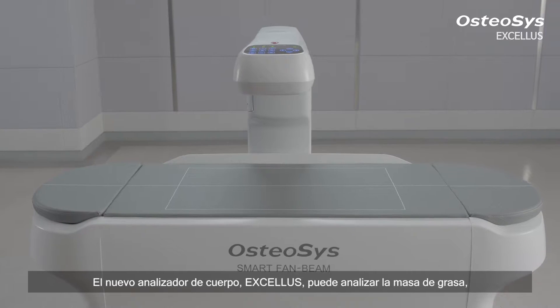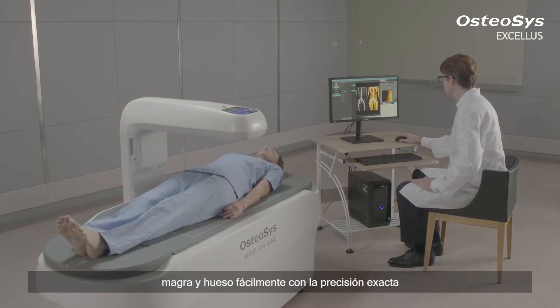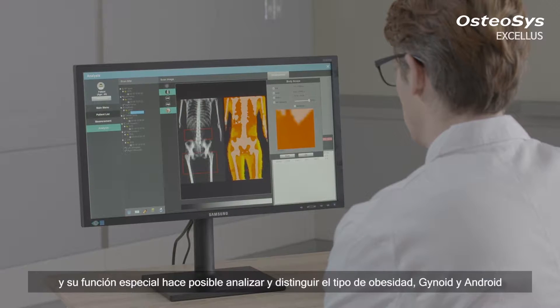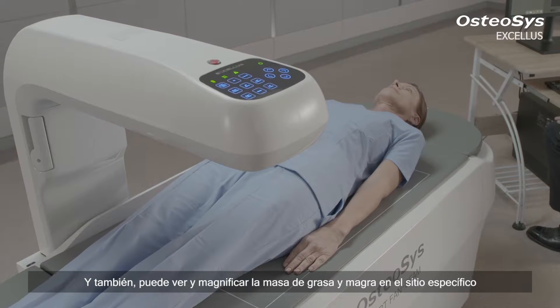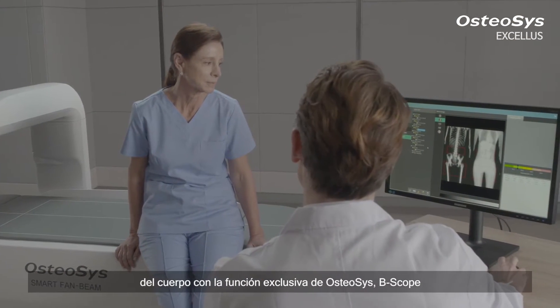The new body analyzer EXCELLUS can quickly and easily analyze fat mass, lean mass, and bone mass with the utmost accuracy. Its special function makes it possible to analyze gynoid and android. You can also scope fat and lean mass in a specific site of the body with the OsteoSys-exclusive function of B-scope.